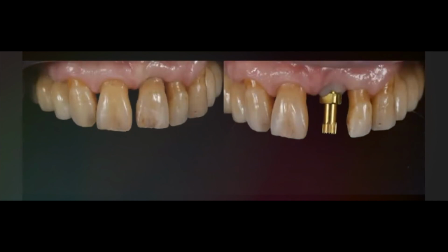Restoration of one single central, really, I can say difficult, a lot of details. So I decided to make this case not with one bake technique. It's not possible to make this case with one bake technique. I decided to combine one bake and internal stain technique.